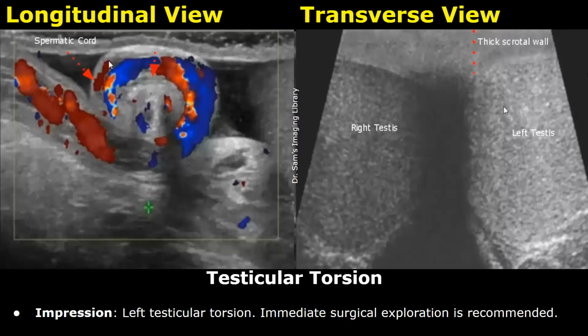Left testicular torsion is written in the impression. Immediate surgical exploration is recommended.